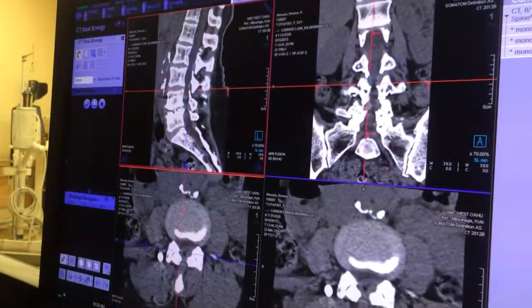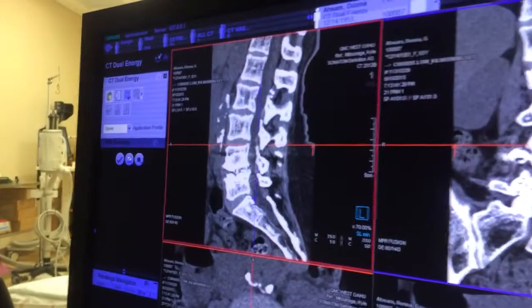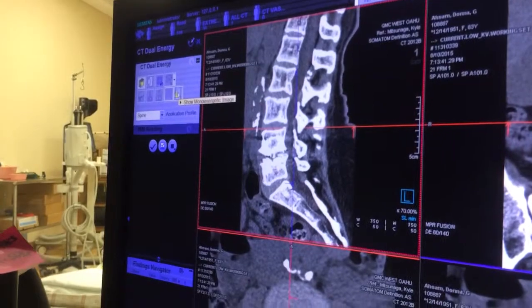So it says verify this, and it looks good. Now, before we do anything, we're going to turn it into the monoenergetics. We click on this little arrow and click on the yellow here — show monoenergetic image.